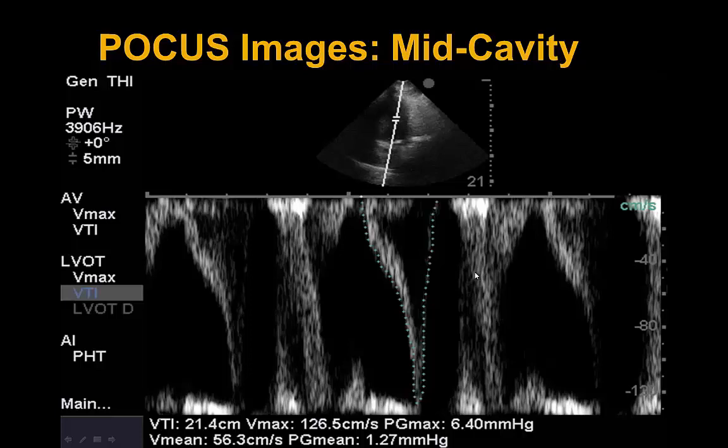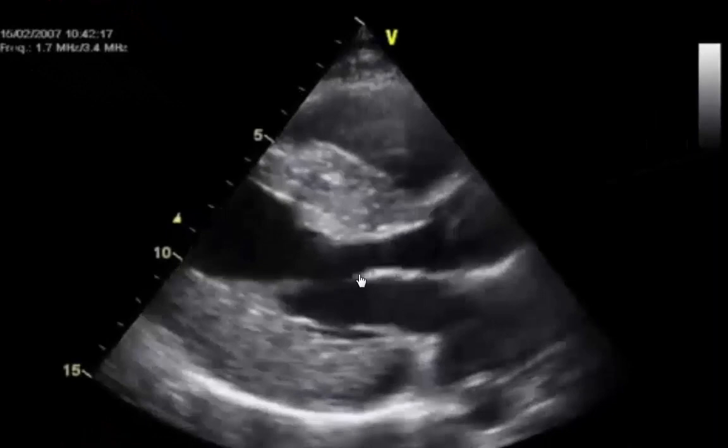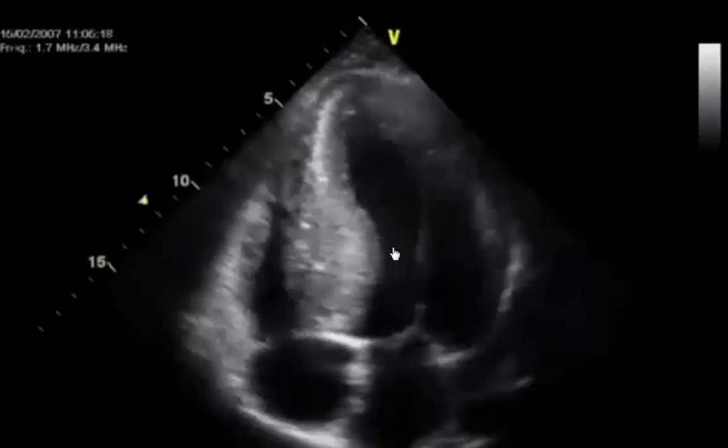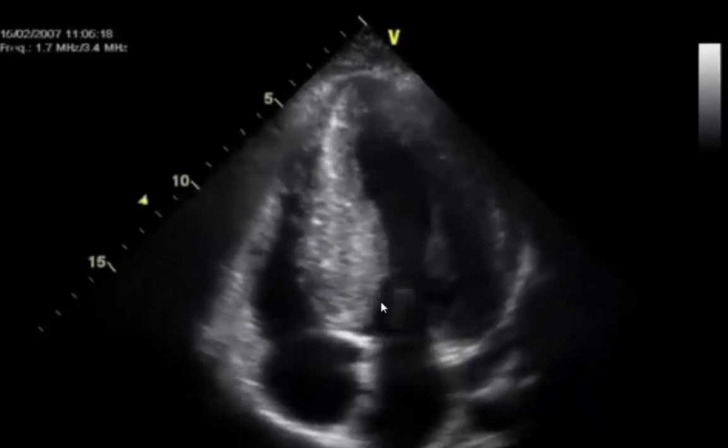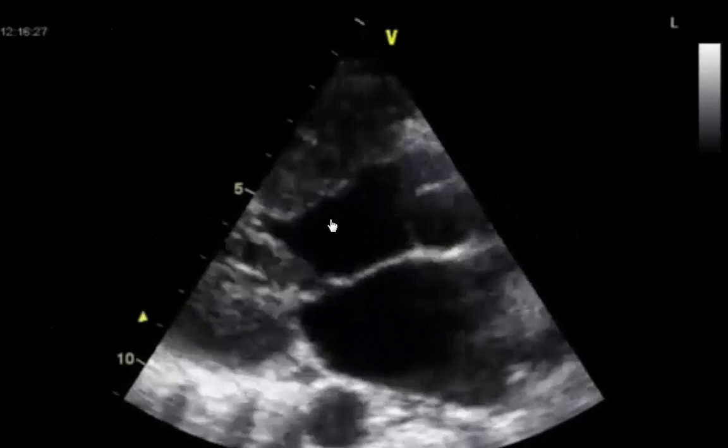Here are classic examples of systolic anterior motion of the mitral valve leaflet in hypertrophic obstructive cardiomyopathy. In a slow-motion clip, the anterior mitral valve leaflet is actually touching the septum and thereby occluding the LVOT. This is demonstrated in another example as well, where the anterior mitral valve leaflet obstructs the LVOT and causes the gradient.